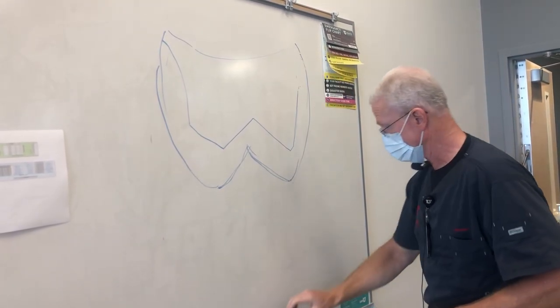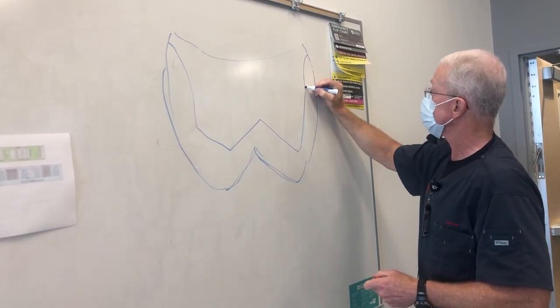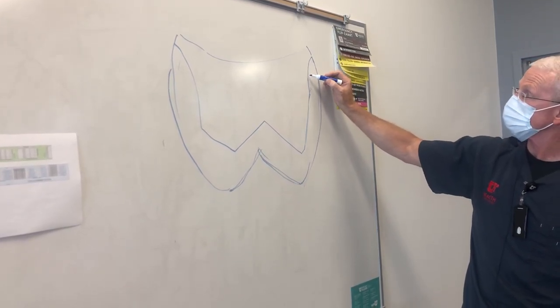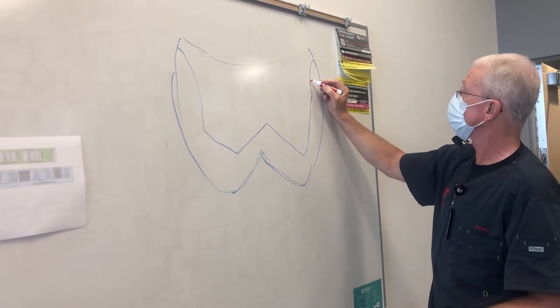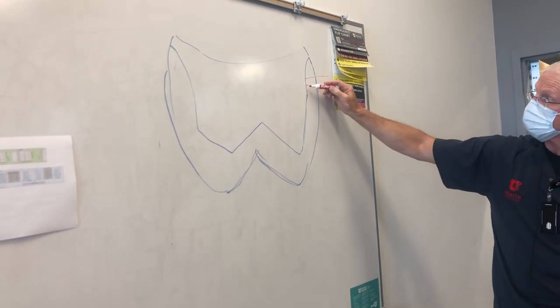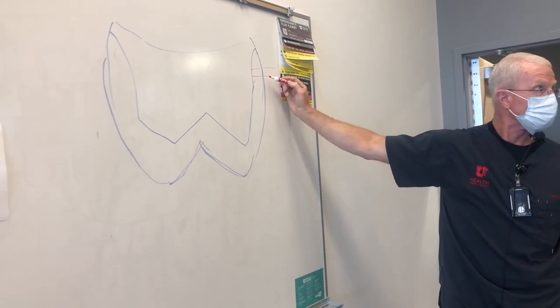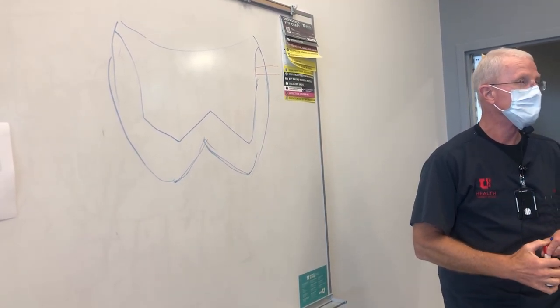this long sloping margin that not only changes as you go more occlusal, but this changes out here that you just cut away. So by the time you get to an axial wall, you may be clear up in this area. And now if you put your perio probe in, well, okay, I think we've got an axial wall here, but my reference is not where the margin is. It's out maybe a half millimeter. You've just cut that off. So how do you measure? You do it with your eyes, pretty much.